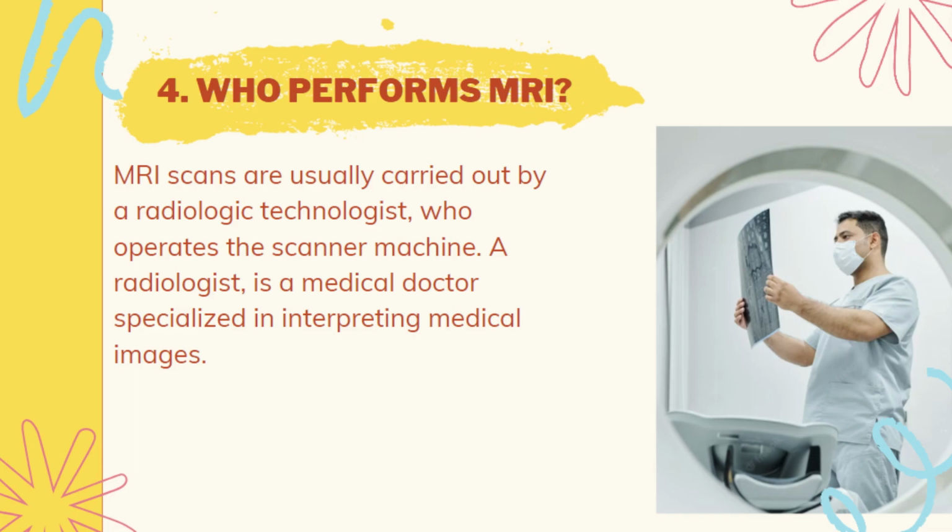For your information, neurologists use the MRI machine to assess the structure and function of the brain. Orthopedics use the MRI machine to evaluate musculoskeletal structures such as bones. Okay, these are just a few examples of the healthcare professionals who use MRI in their practice. The versatility of MRI makes it a valuable tool across various medical specialties for diagnostic purposes, treatment planning, and monitoring of patients. Okay, that's for number 4.